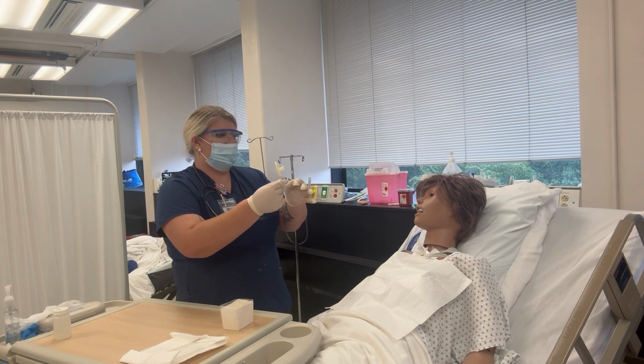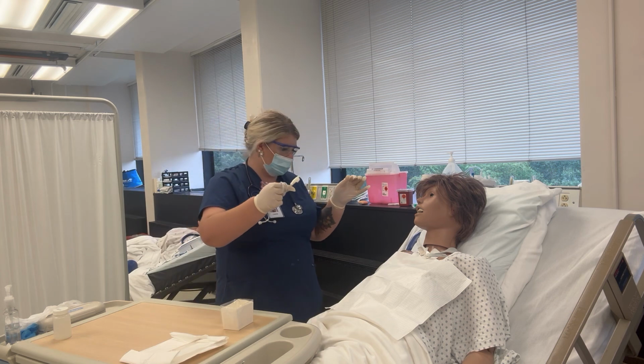With our non-dominant hand, we are going to insert the end into the suctioning.